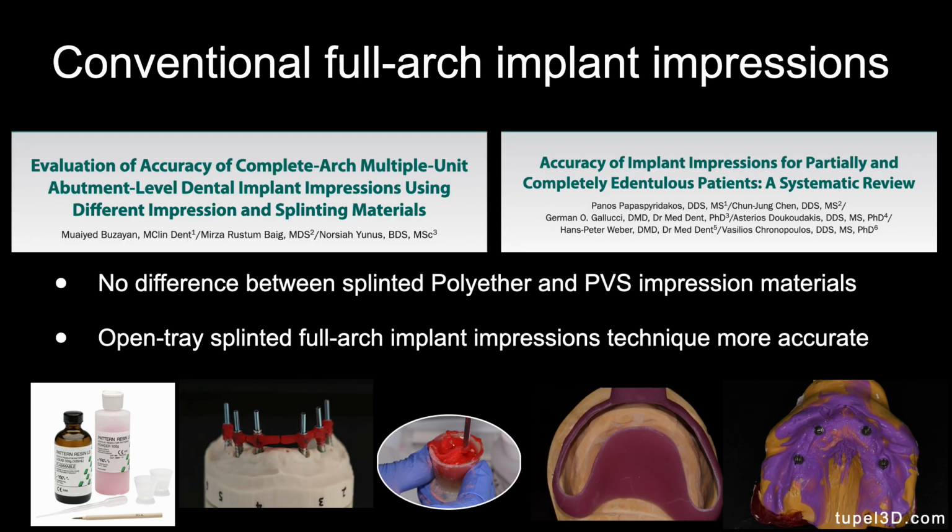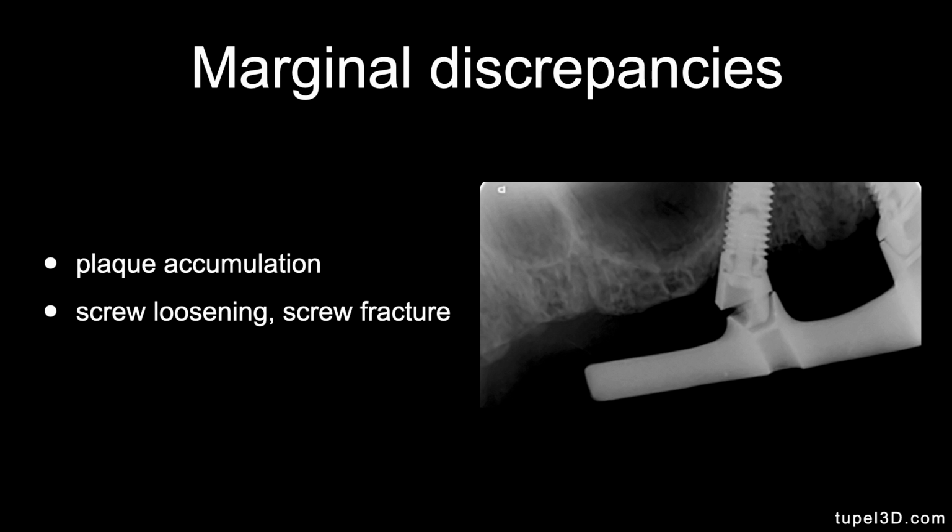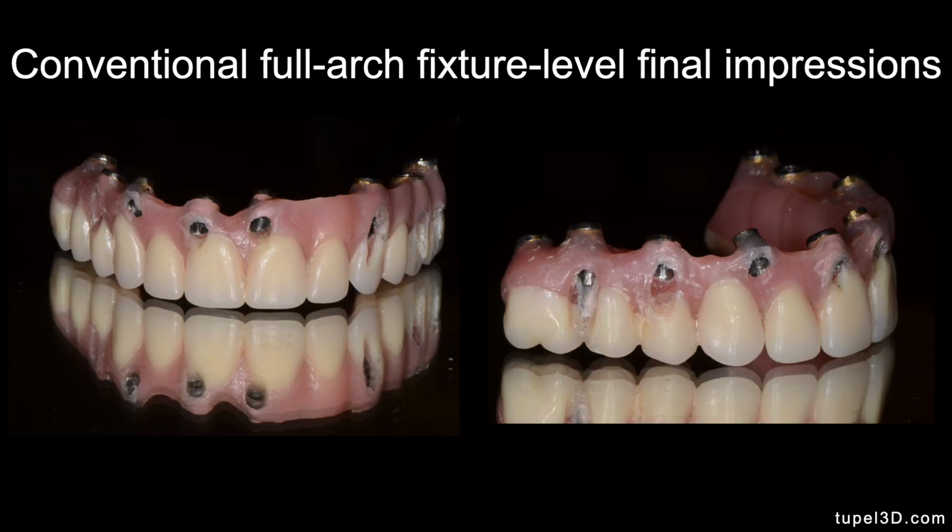The way we conventionally take a full arch implant impression is with an open tray, a rigid splint, and a polyether or PVS impression material. This technique is well recognized in the scientific literature, and it's very important to have a rigid splint because otherwise the presence of marginal discrepancies can lead to biologic and mechanical complications.